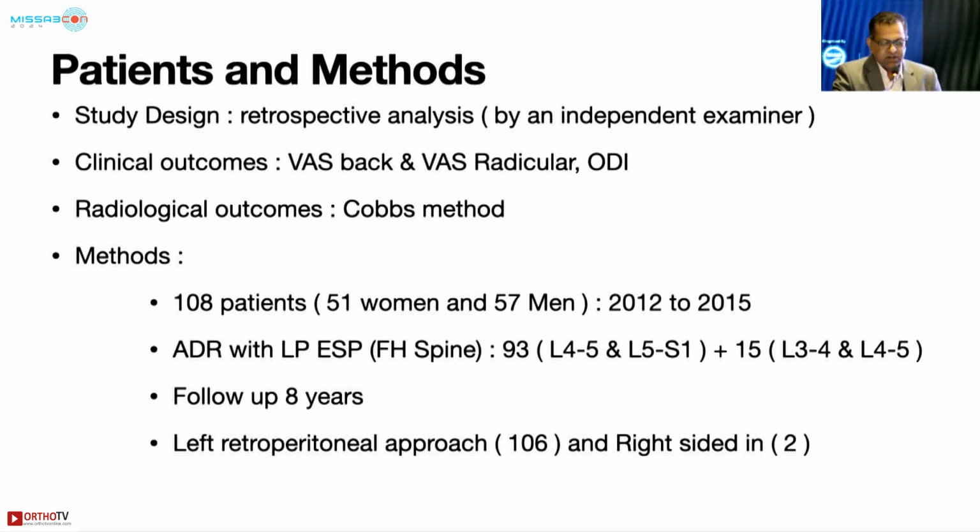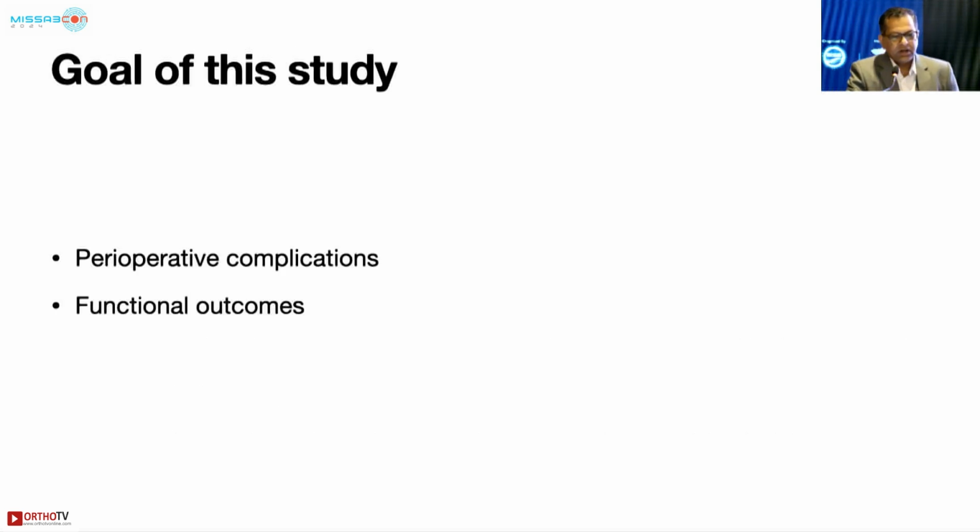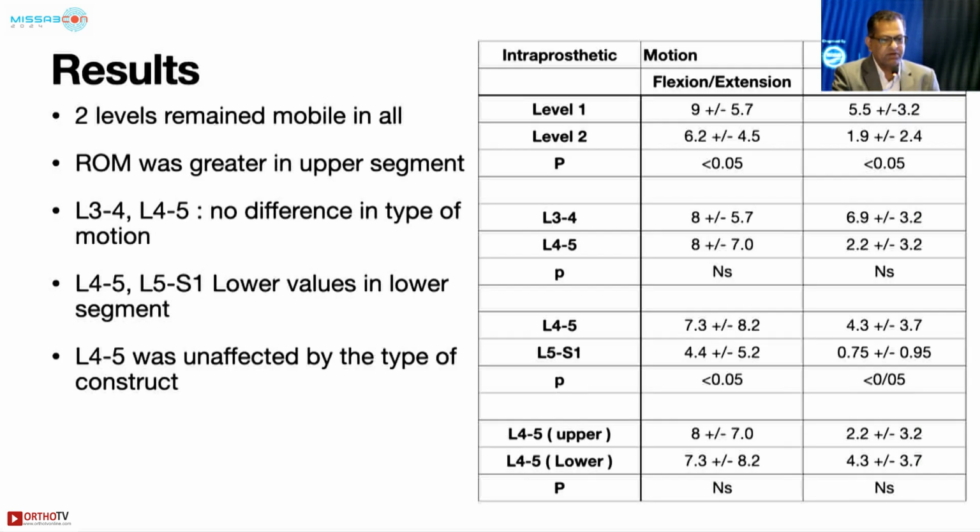Most of the patients were done by the left retroperitoneal approach, but we did right-sided approach in 2 of the patients. The goal of this study was to evaluate the perioperative complications and also the functional outcomes of ADR. And these were the results.